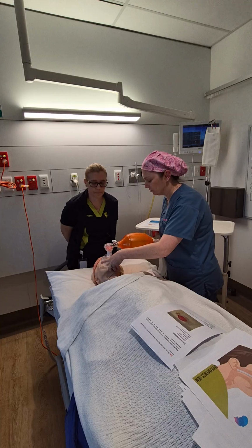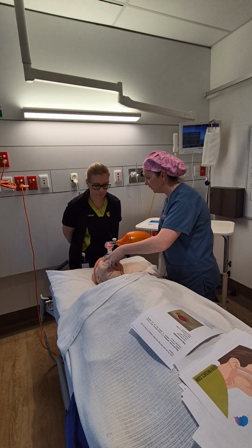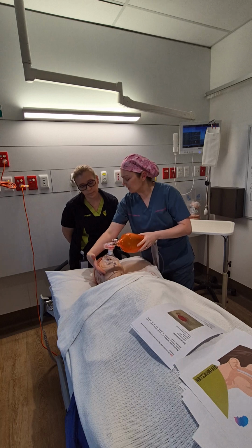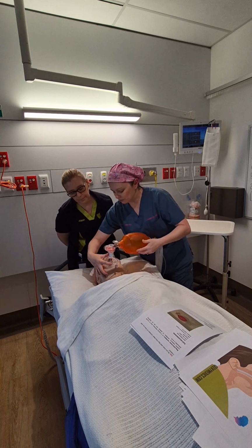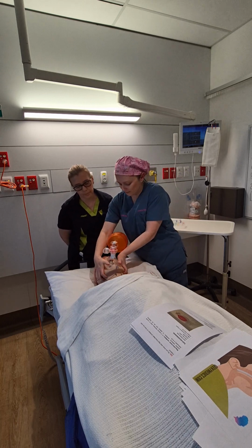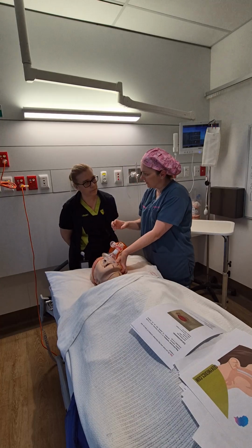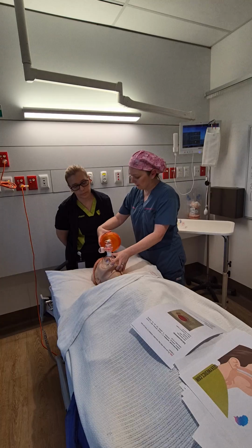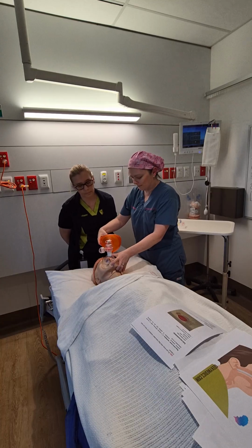Now you can also do a little bit of jaw lift and chin lift. You can use your two fingers. That's why it's nice to have your thumbs free. So you can either do it with two hands, where you have it like that, and then somebody else ventilates for you, or you can do one-handed ventilation, and you'll go like that.